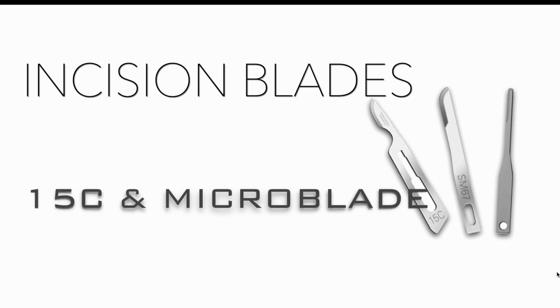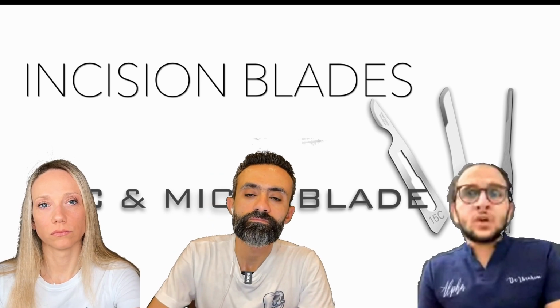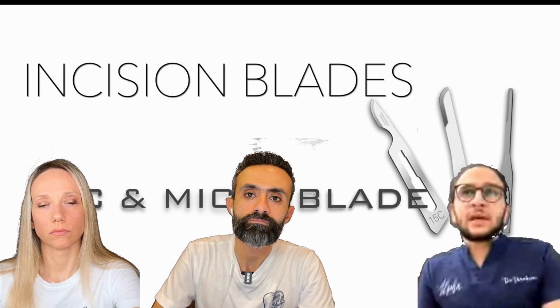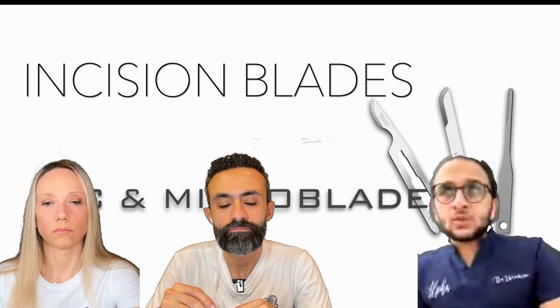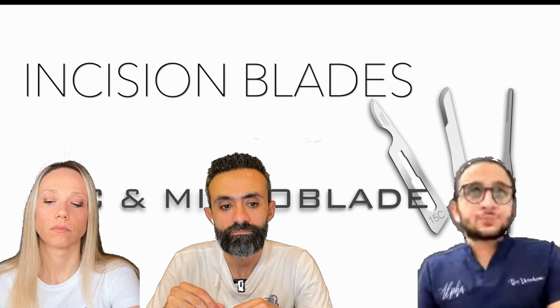After that, we go to the incision, and as we said, it's a microsurgery, so we need to rely on a small size of blades. For this, I'm using a 15C blade when I have to go inside the papilla, and a microblade when I'm not going to include the papilla in the incision.